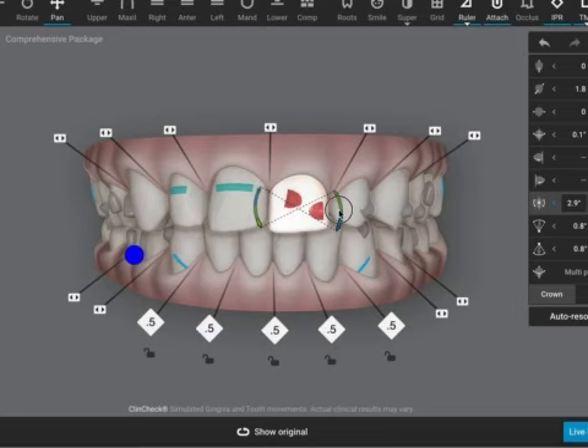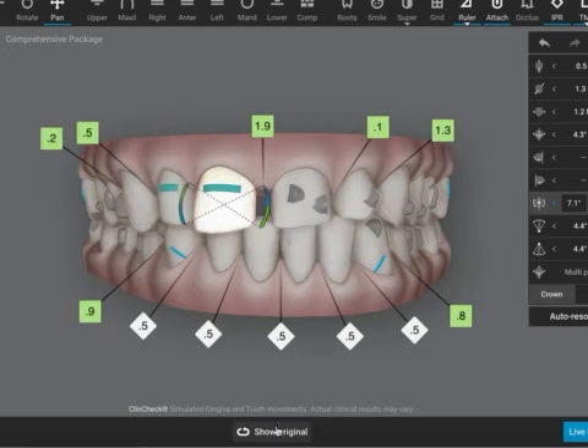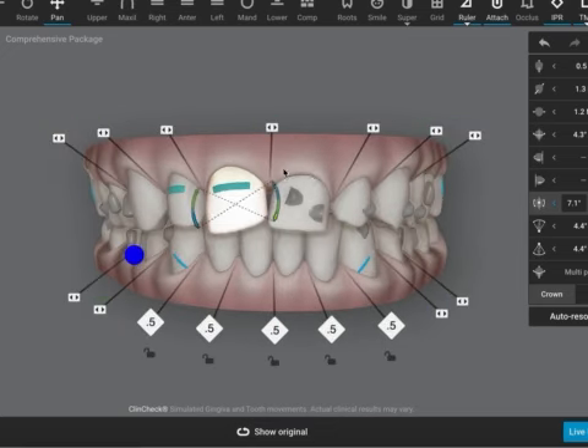Even with all the correction, the teeth can still look a bit tipped at the end. You might actually end up with both these teeth looking a bit tipped, so you will need a couple more refinements. Also, you can get gingival bunching and contouring here as the patient's teeth move closer together — especially here — because of how much space there is as they're being moved.